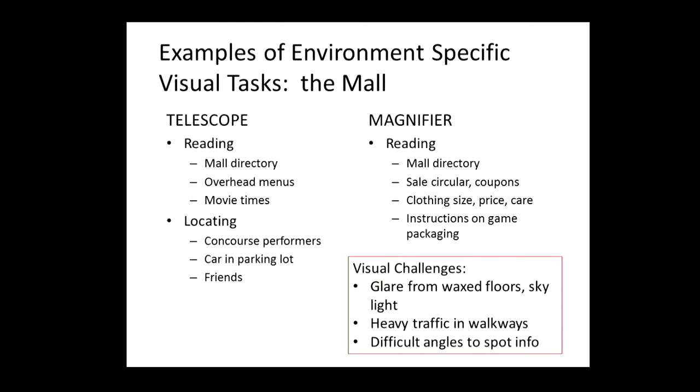And the student being able to see that and tell the parent what that is. Finding out what the services are at the customer service desk. Being able to read the digital screen as the cashier is checking out the items, are the correct prices being displayed there. So each of these are good opportunities for the student to use a telescope.